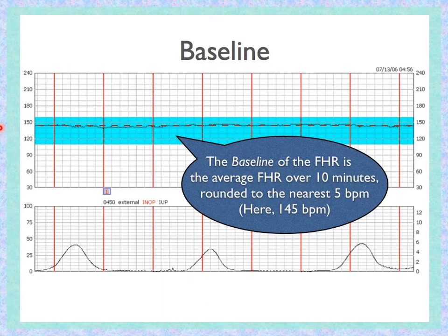The baseline of the fetal heart rate is the average fetal heart rate over 10 minutes, rounded to the nearest 5 beats per minute. In this case, it would be around 145 beats per minute.